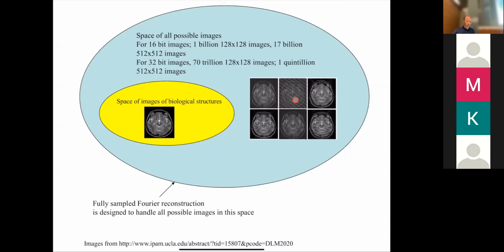And basically, you should be able to figure out, even if your Fourier recon or your parallel imaging recon says that this is a possible solution, you know it's not a solution. So you should drive your solution away from here into this space. Okay, so that's what compressed sensing and deep learning are going to be doing. Okay, and because of that, they are able to do things that almost look magical. Okay, because what you're adding to the sauce now is prior assumptions. Okay, and for those of you, are there any Bayesians in the audience or online?